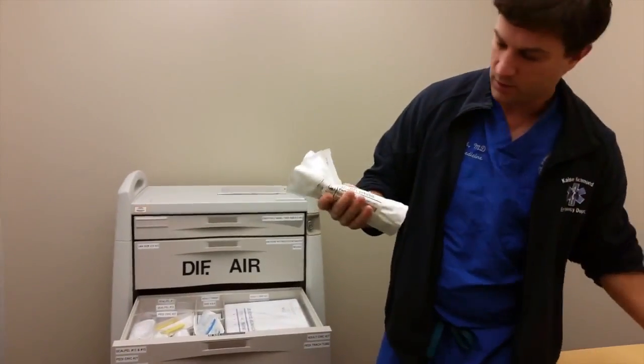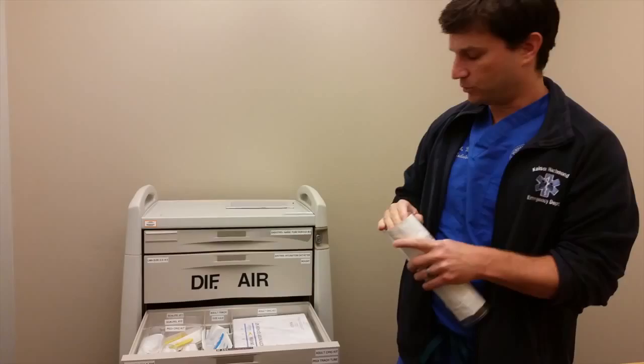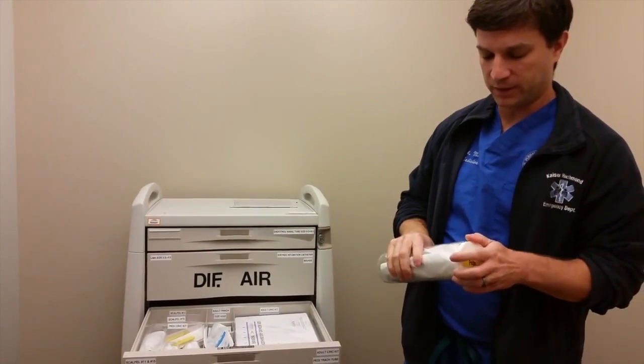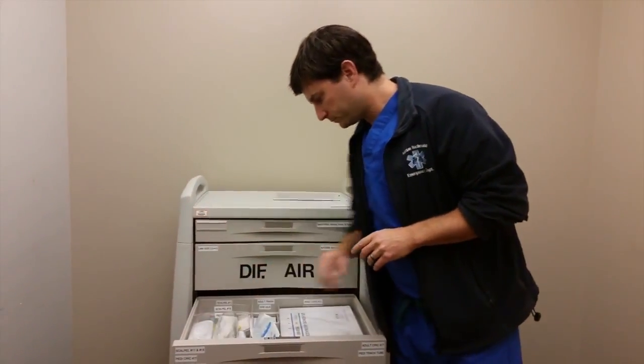The problem is that they're a little old and you can't get great visualization as you will with the surgical technique. So we do prefer the open technique if we can with a blade, just so you can really see your anatomy better than doing percutaneous in an adult often.